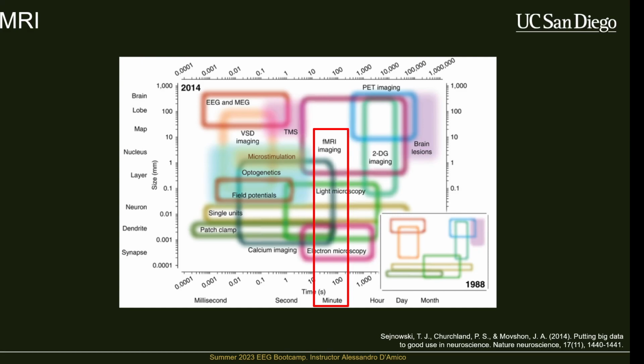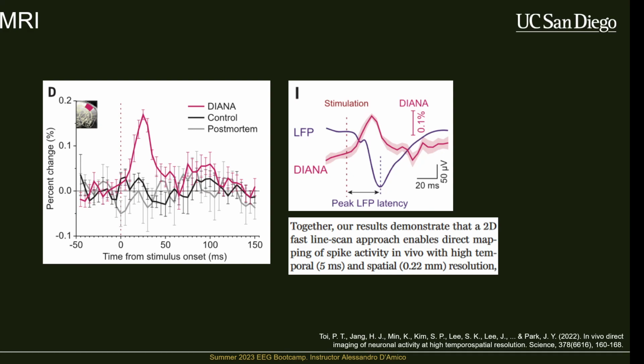So we typically talk about this in hertz, but you can also talk about just the order of time that it takes to get one scan, for example. So this could be in the order of 10 seconds to a minute, depending on how deep your scan is, how many layers you're doing. There are technologies for trying to speed this up.